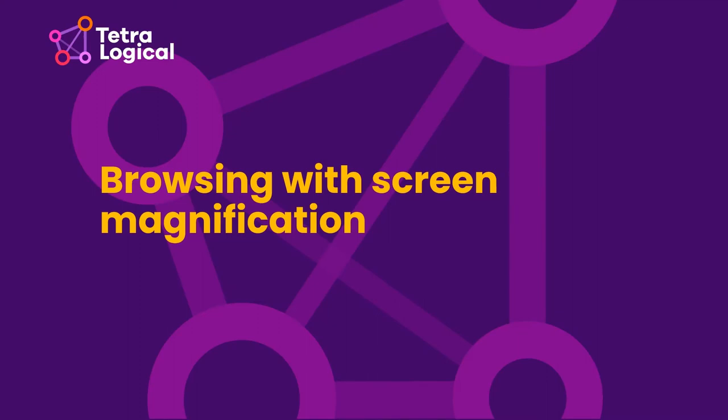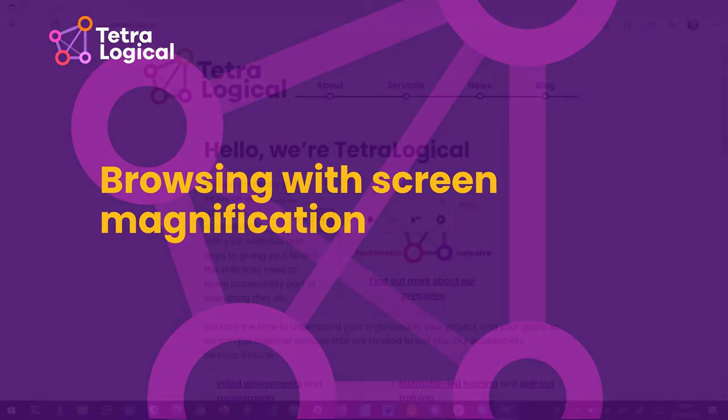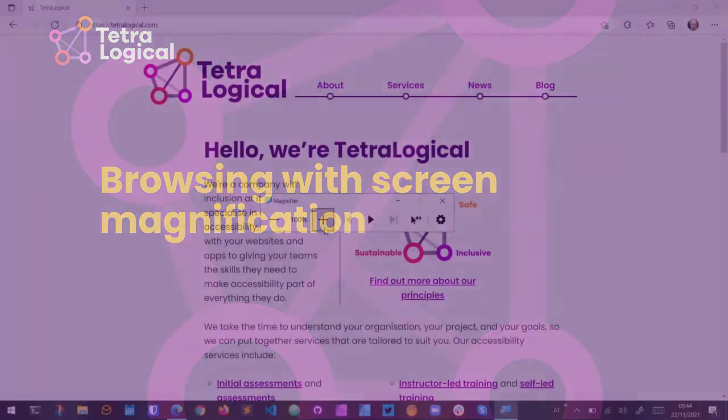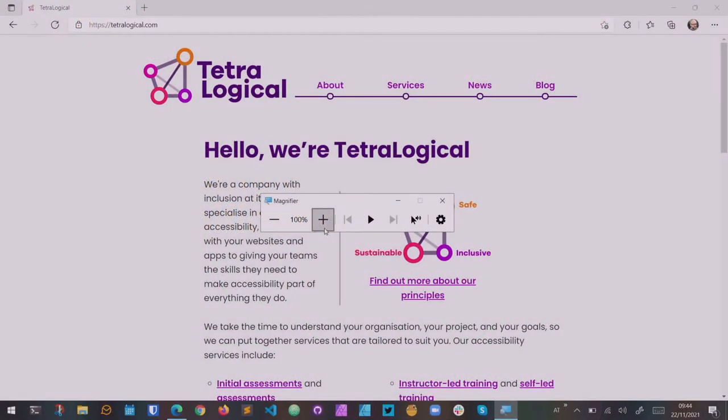Browsing with screen magnification. Screen magnification works by zooming all or parts of the screen as if you're looking through a magnifying glass.